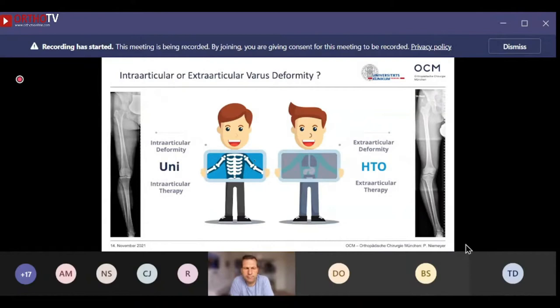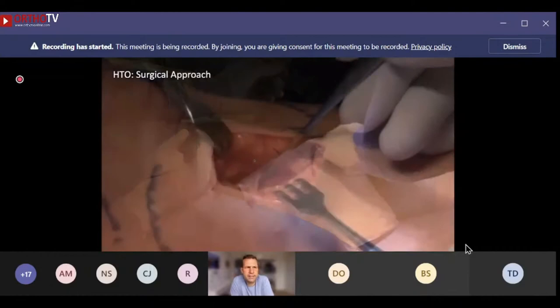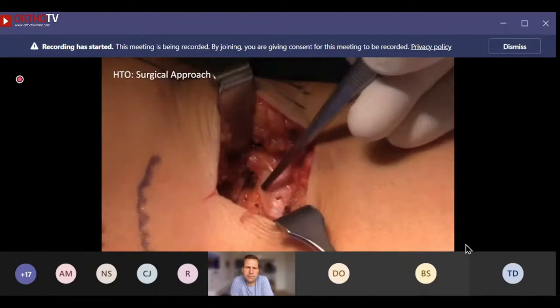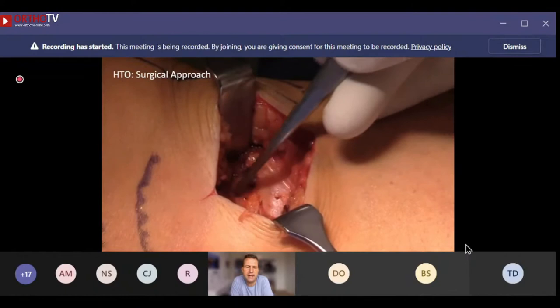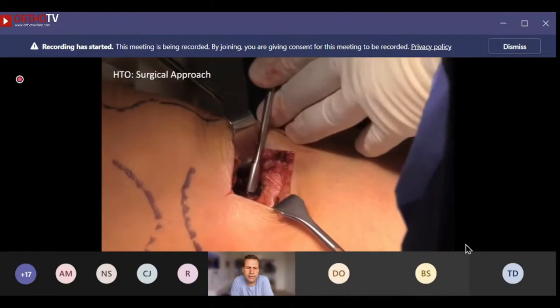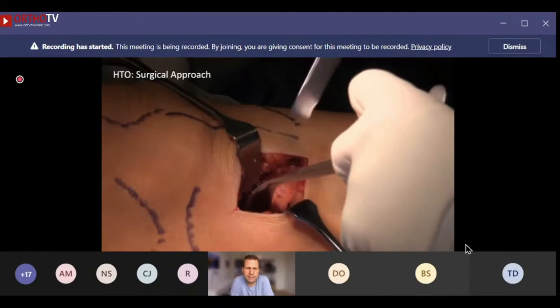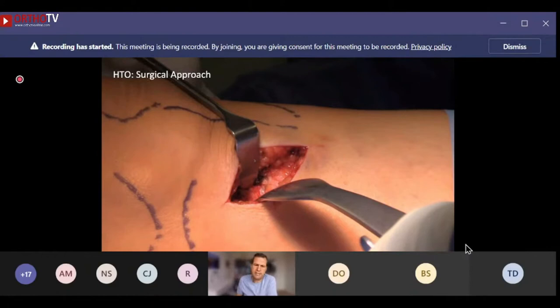We use the TBVA to distinguish indications between unicompartmental knee replacement and HTO: with an intra-articular deformity we prefer unicompartmental intra-articular therapy, whereas a pathological TBVA represents an extra-articular deformity indicating HTO. Surgically, we approach through the ramus infrapatellaris, identify the pes anserinus and medial collateral ligament, and go beneath the superficial MCL fibers — a preparation taking about two to three minutes — then place a hook posterior to the tibia to protect neurovascular structures.